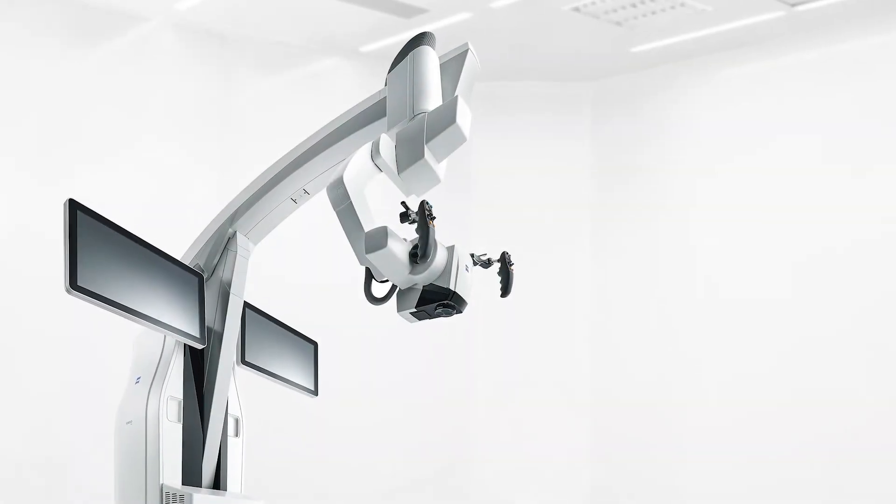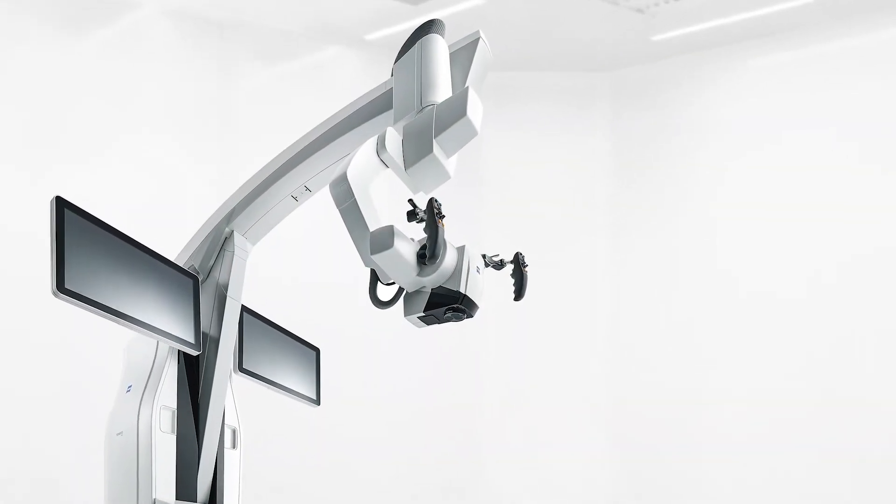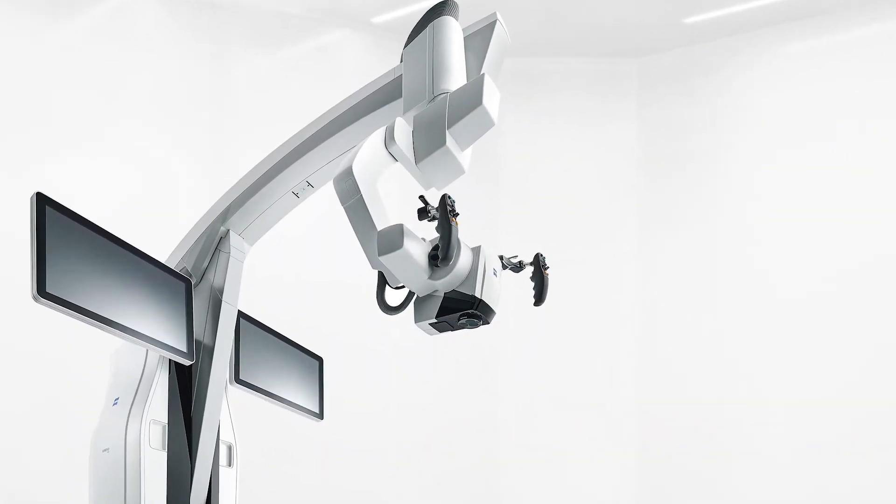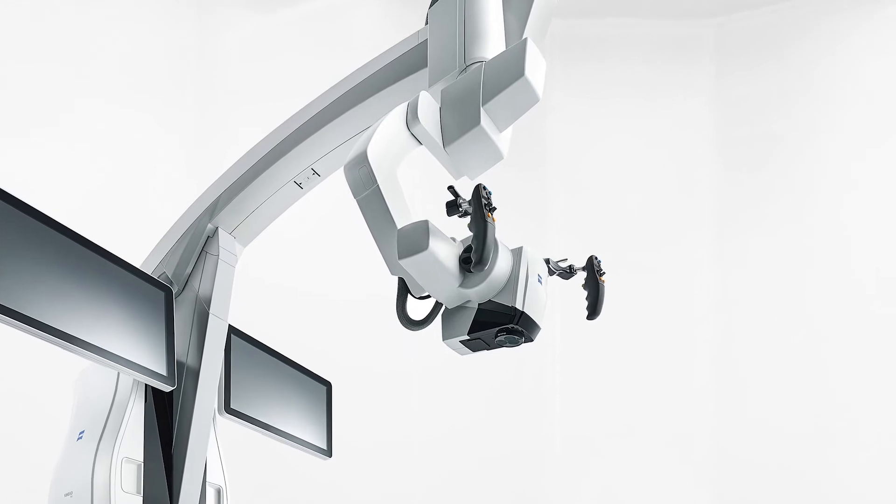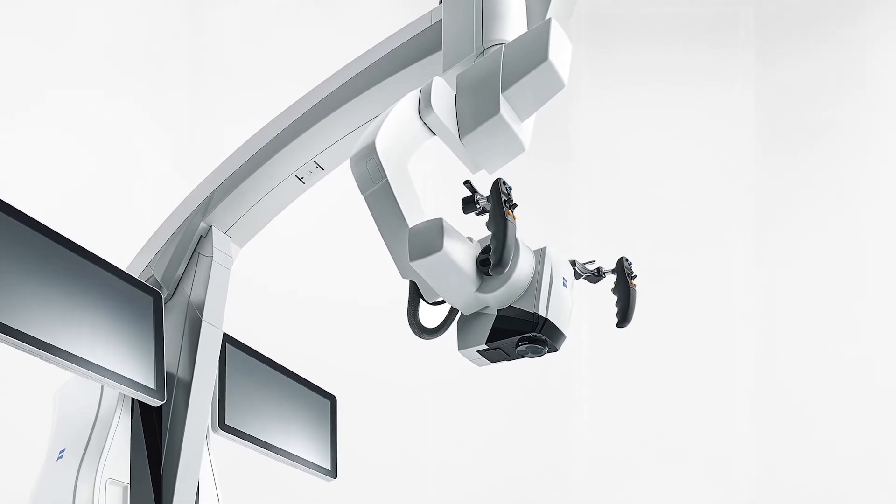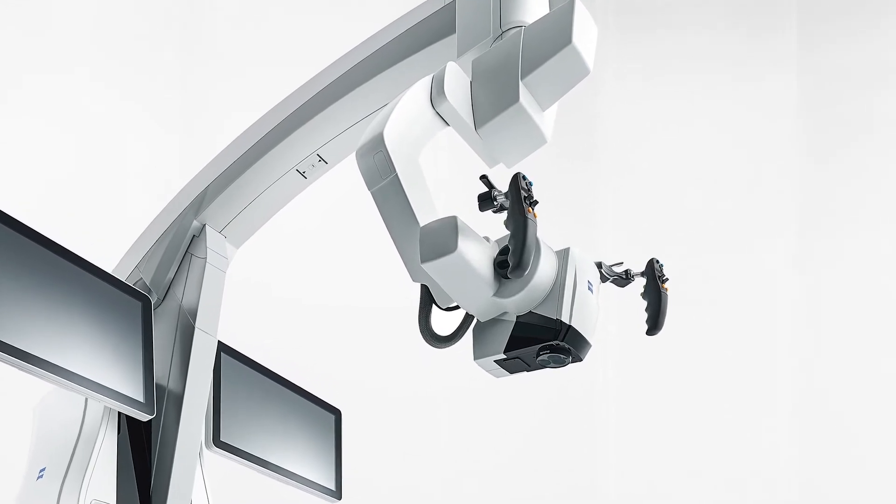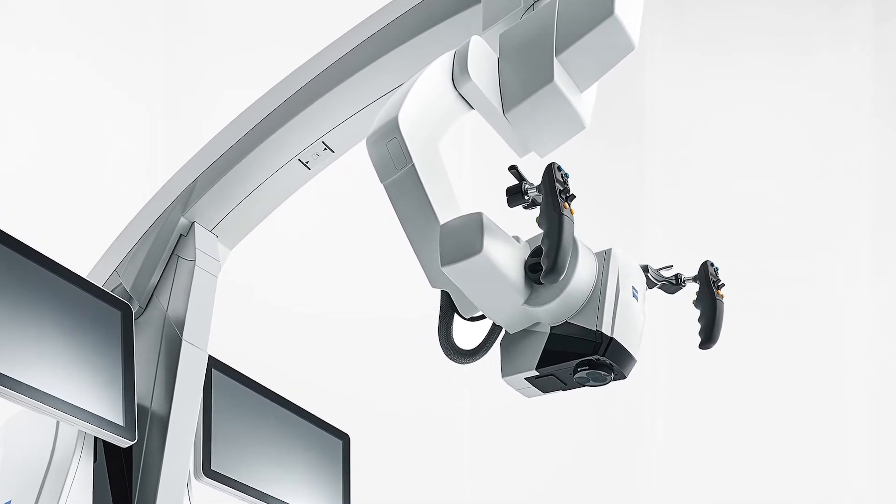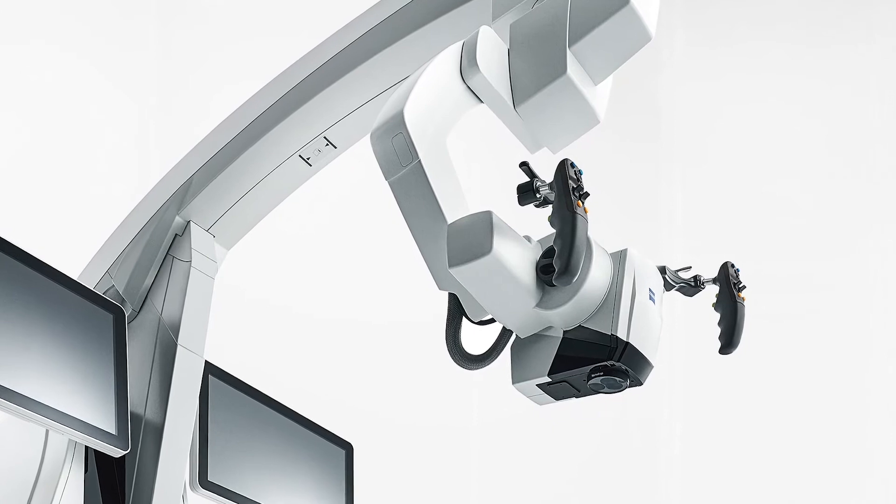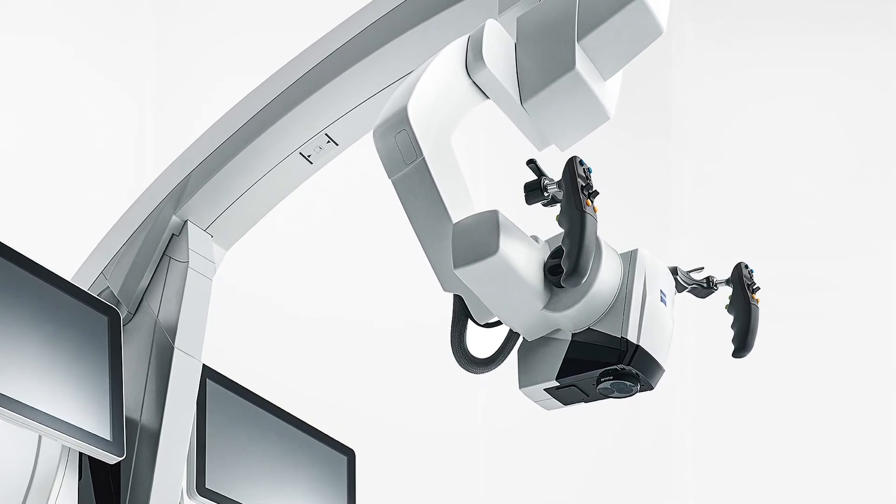Zeiss Kinevo 900 offers the ability to store and return to the exact same positions, including focus and zoom settings during an intervention, enabling workflow efficiency.